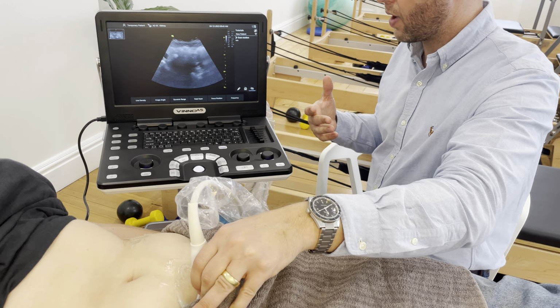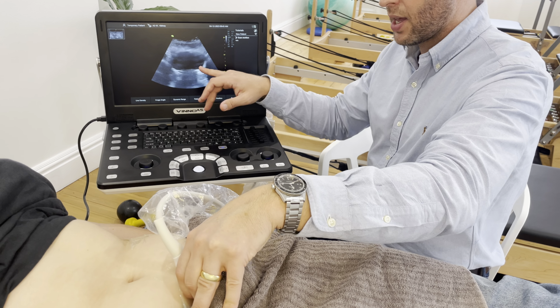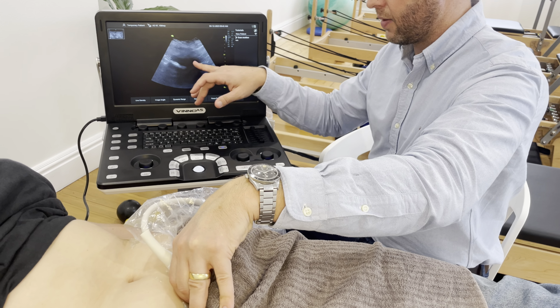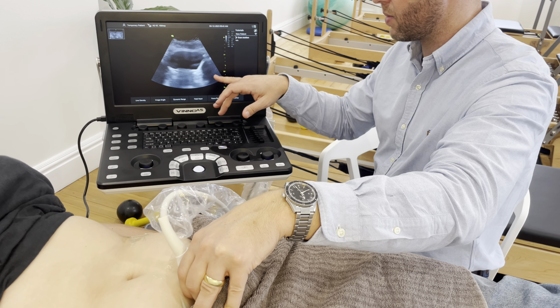And we're just going to use that as an indirect measure of our pelvic floor muscle activity. So if I tilt and rock the probe, I can start at the very beginning of the bladder, and as I angle down, I come to the middle of the bladder here. We can see that's the largest portion, and then if I keep going, I find the other end of the bladder. So I'm going to just position myself somewhere in the middle here.